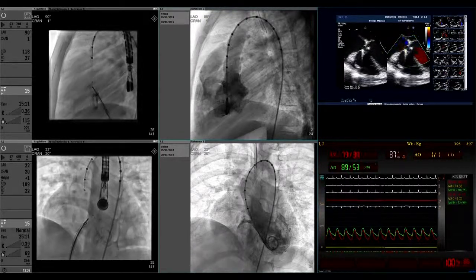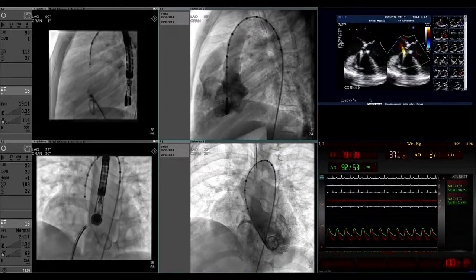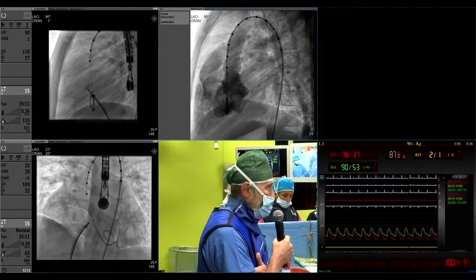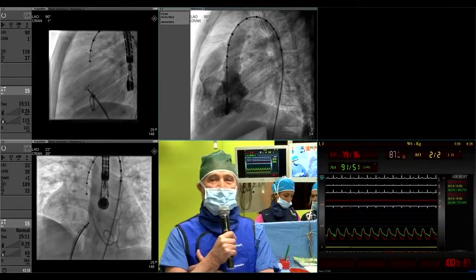So thank you very much for your concern, Dietmar, but I'm pretty sure that when Tin releases the device, it will stay there in the VSD. Mario, I was going to make the point that shows Dietmar's incompetence, not the device.